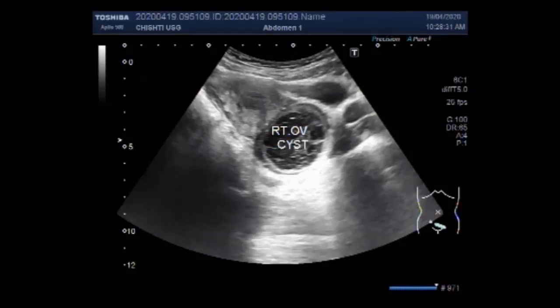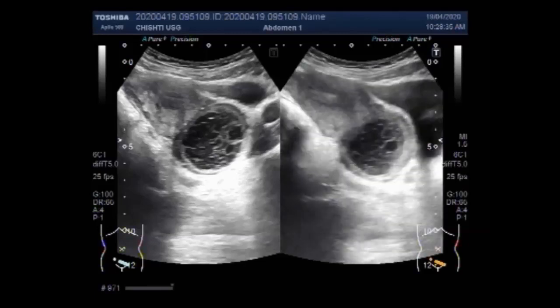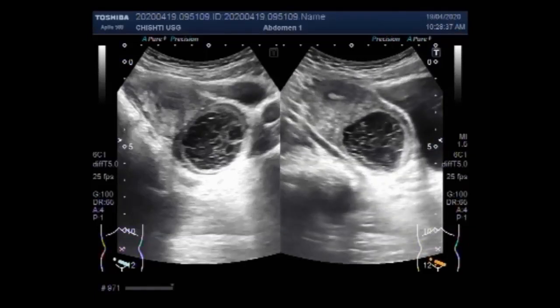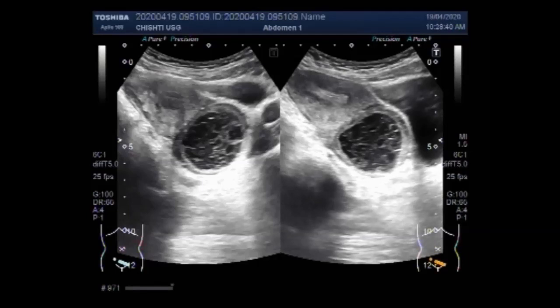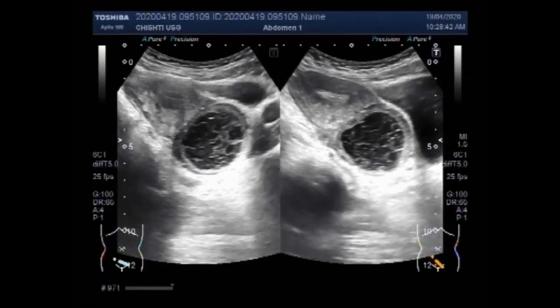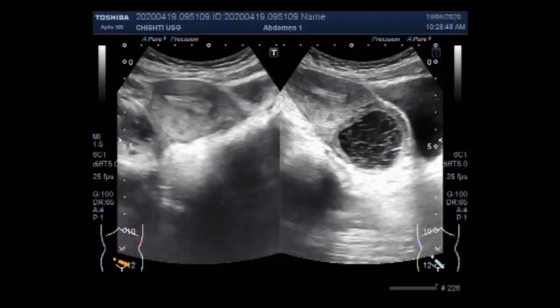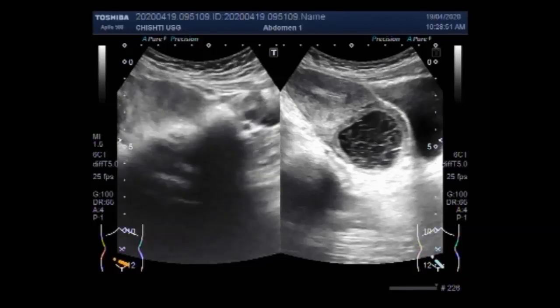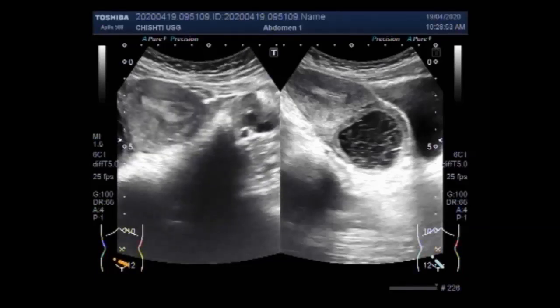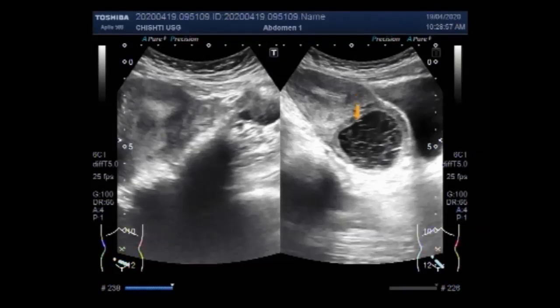You can see the right ovarian cyst, which is a hemorrhagic cyst. A hemorrhagic ovarian cyst is an adnexal mass formed because of bleeding into the follicular or corpus luteum cyst. Hemorrhagic cysts are commonly seen in clinical practice because hemorrhage into a cyst is usually painful, triggering the patient to consult her physician.